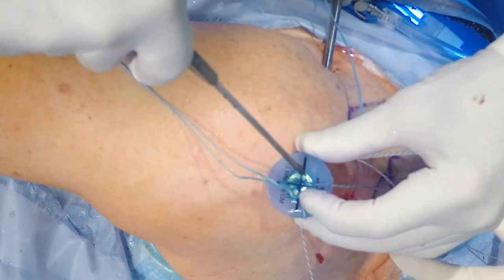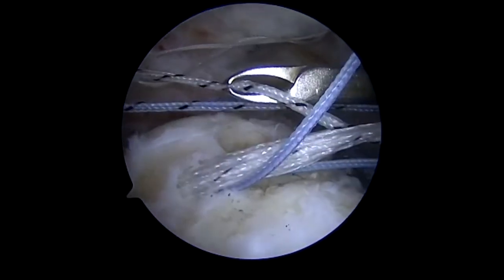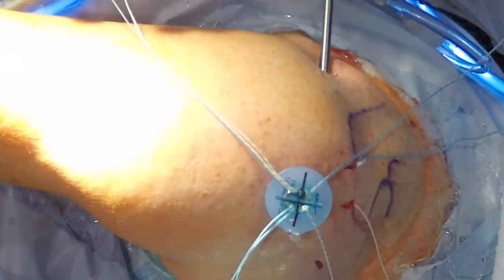This one's posterior. That device, as you see there, separates into four quadrants.